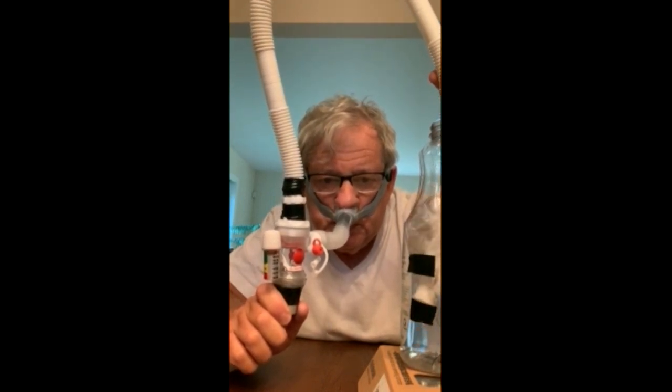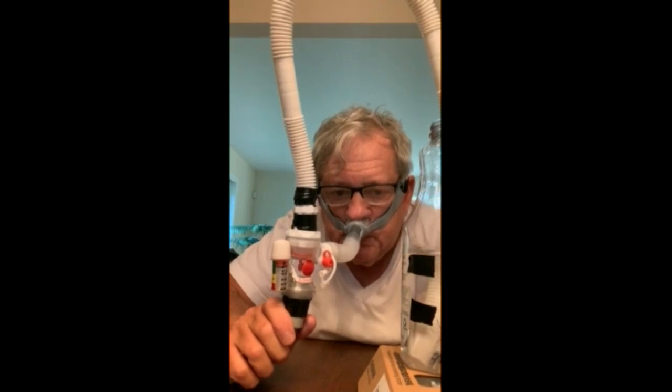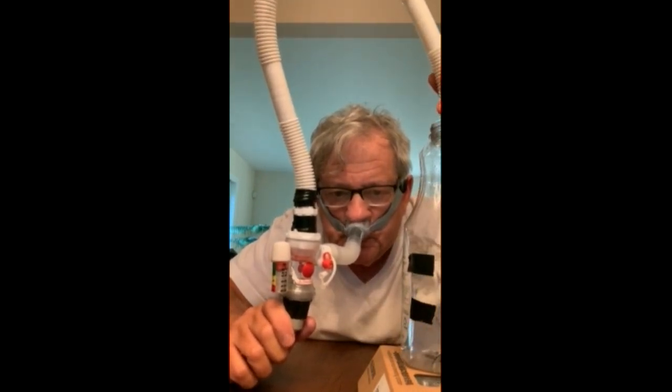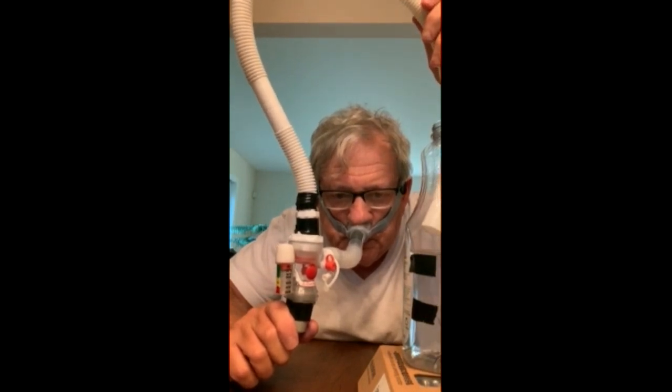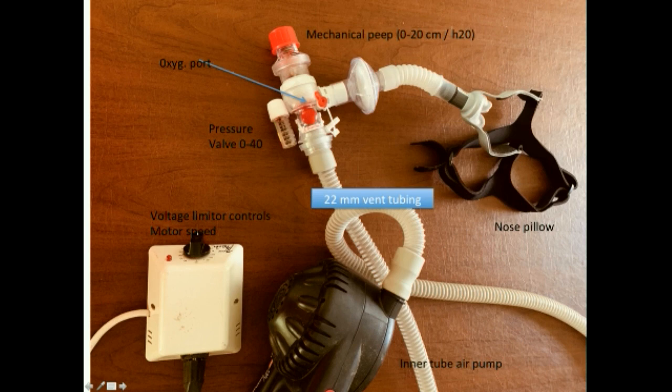I will replace the red mechanical PEEP valve with a water column. I'm starting with PEEP of 10. Now the PEEP is 5. We'll repeat. This time, carefully watch the expiration valve. When the airflow is turned on, it holds the expiration valve open at the PEEP setting of 10. But it doesn't matter if you remove the PEEP — it stays at 10. What this shows is that the motor's speed, airflow, and resistance of the expiration valve determine the PEEP level. So you don't need a mechanical or water column PEEP.